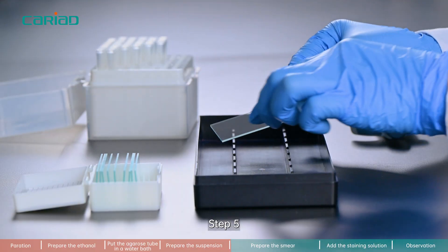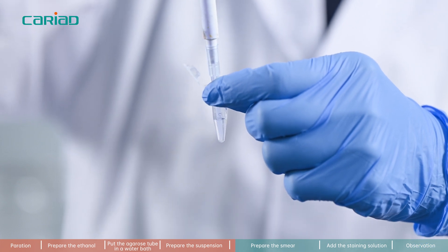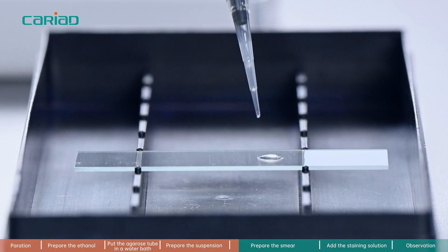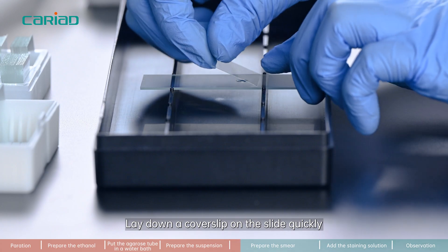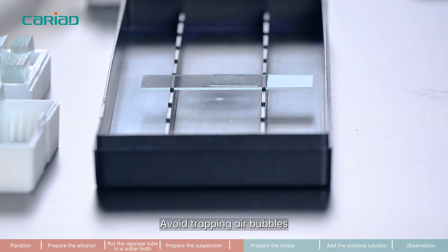Step 5. Take 30 microliters of low melting point agarose with sperm and place it on the horizontally positioned pretreated slide. Lay down a coverslip on the slide quickly. Do not press the coverslip — avoid trapping air bubbles.